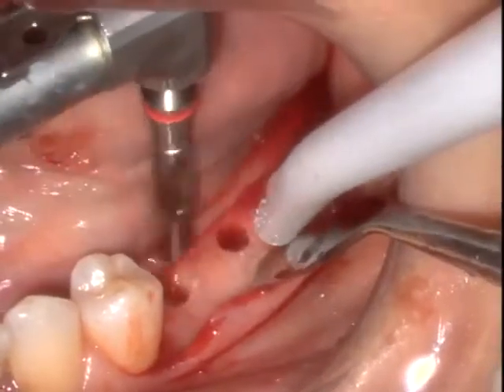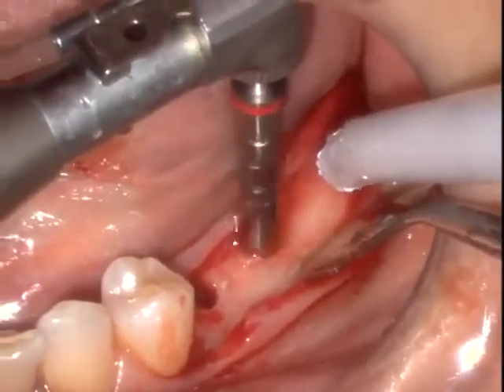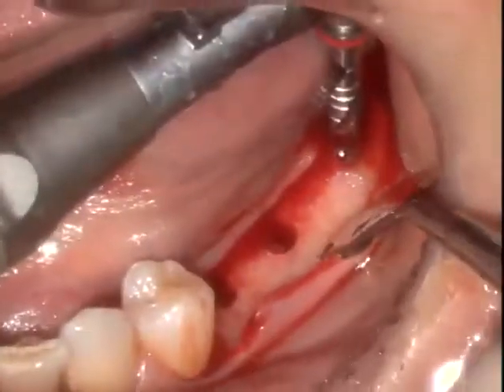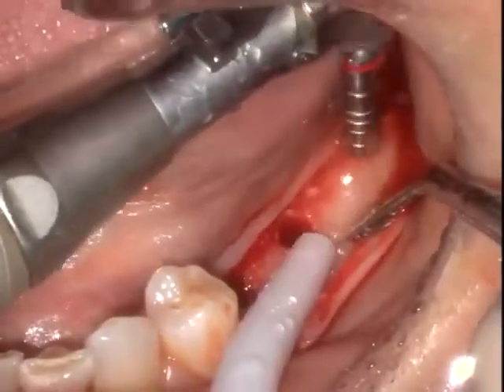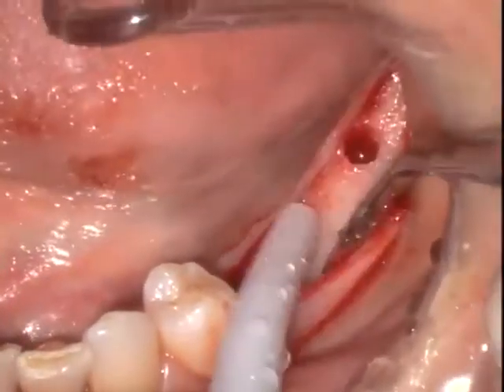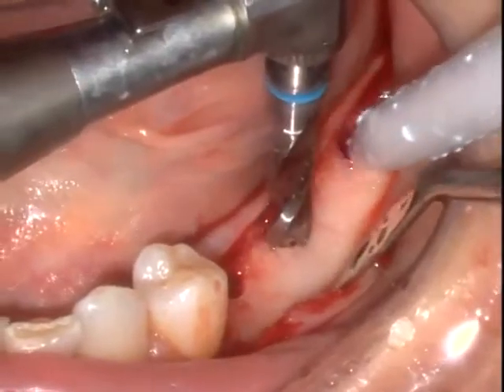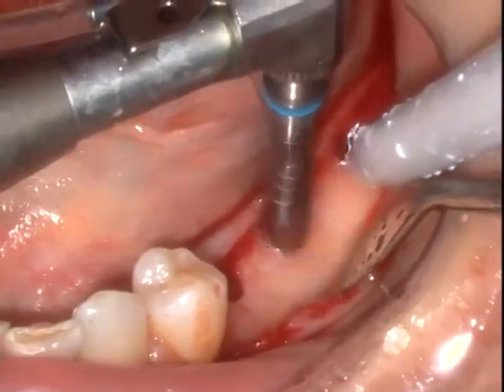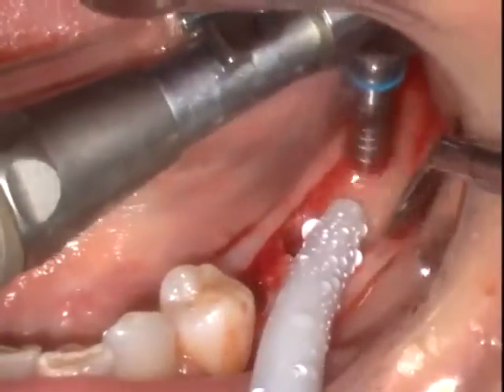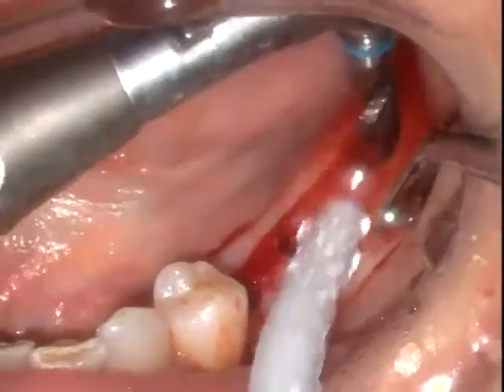The final drill for the 3.75 millimeter implant is inserted. Again, you can see how we move from one osteotomy to the other, maintaining parallelism in each drilling episode. Copious irrigation is utilized. We try to use cool water, and you can see that these drills turn very nicely. The blue colored final drill for the 5 millimeter posterior molar implants is then inserted, and you can see wider implants in here are handled and managed quite well.